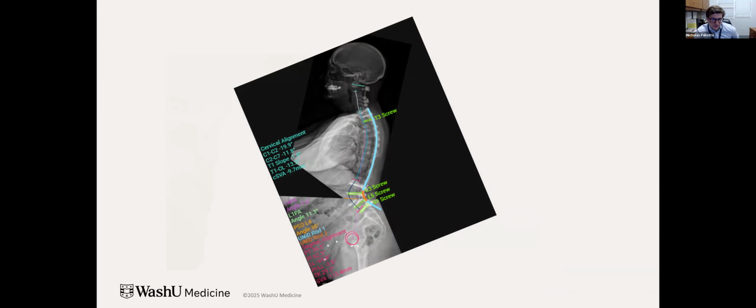how to correct her sagittal plane. And actually what you can see here is I was going to utilize a satellite construct, and I got very small satellite rods created custom so I could see the correction, and then the long rods, which would connect her from top to bottom.